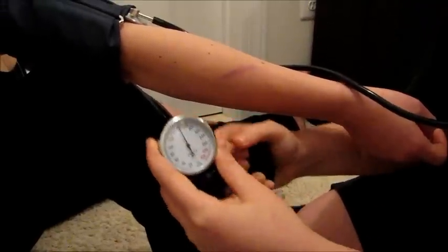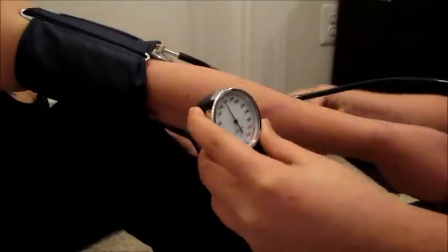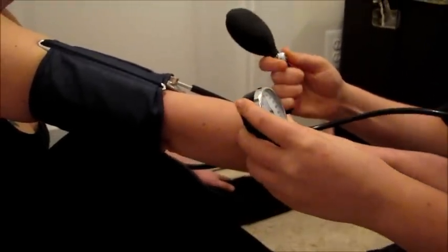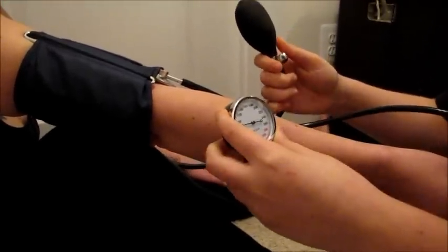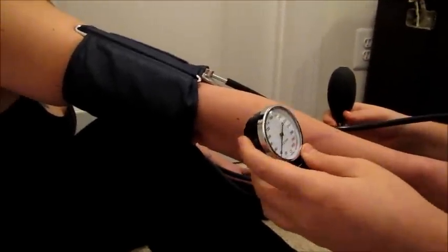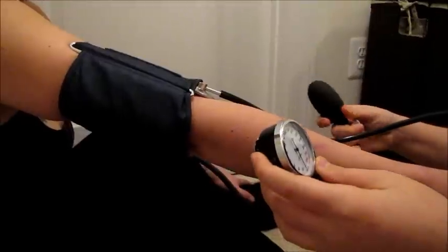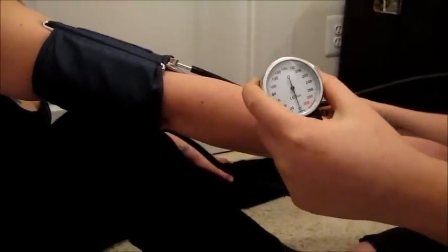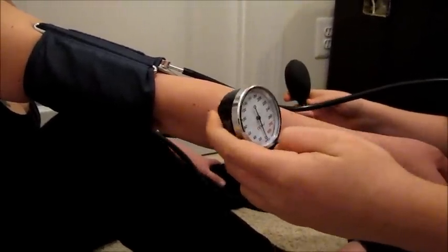Once I pump it up to 160 in the gauge, I will start releasing the pressure just a bit so I can listen to the first heartbeat and the last heartbeat. After that, the systolic heartbeat, which is the first, and the last is the diastolic.